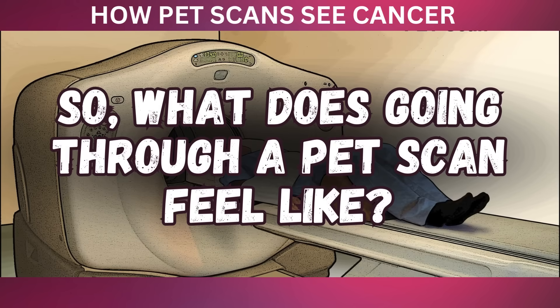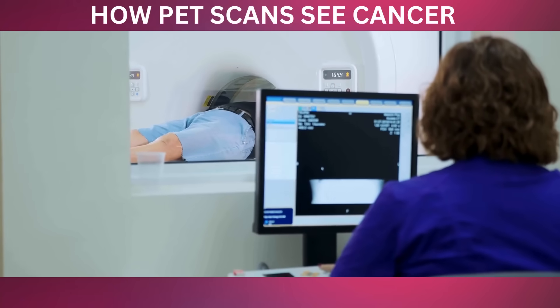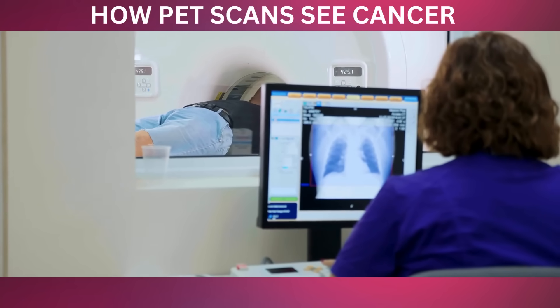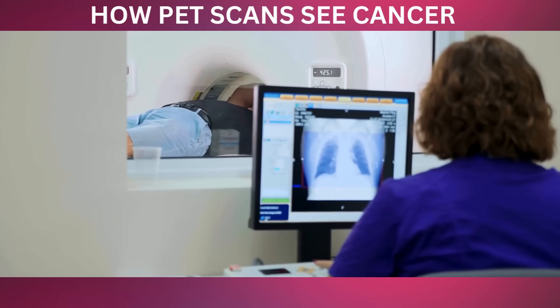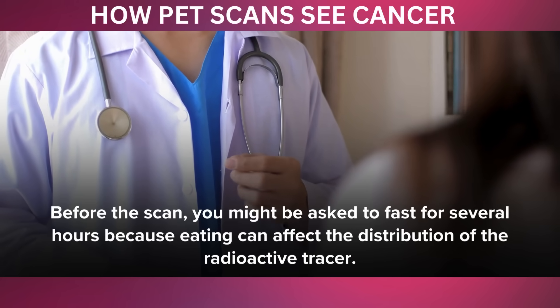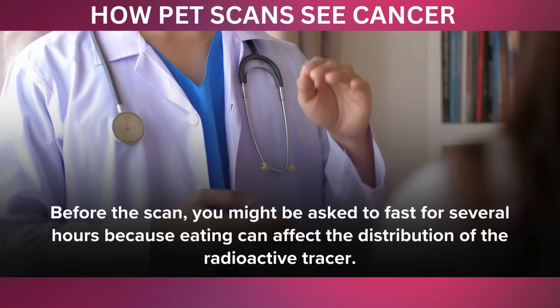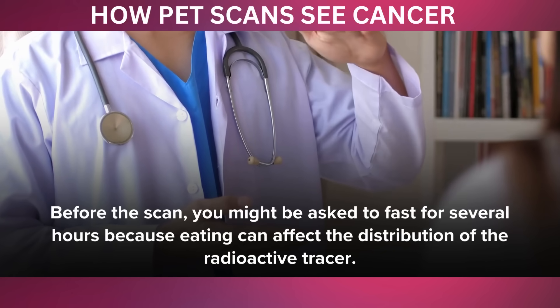So, what does going through a PET scan feel like? Experiencing a PET scan is generally straightforward and non-invasive, but knowing what to expect can help alleviate any anxiety. Before the scan, you might be asked to fast for several hours, because eating can affect the distribution of the radioactive tracer. You'll also be instructed to avoid strenuous exercise for a day or so before the scan.